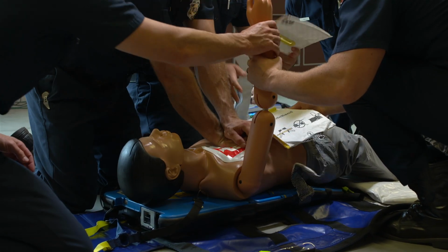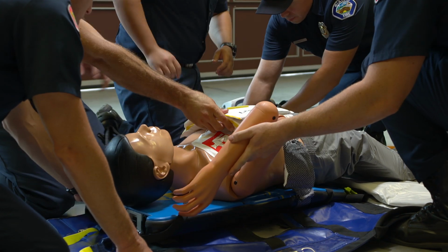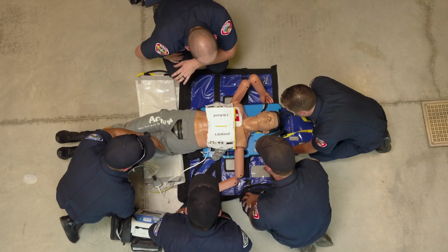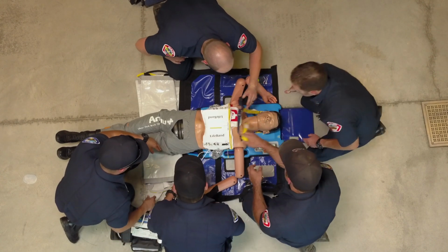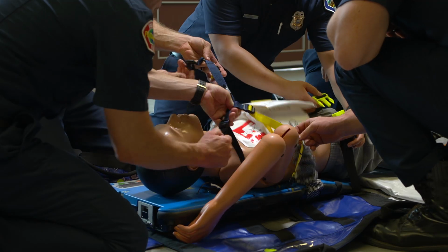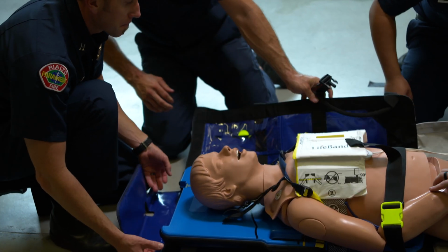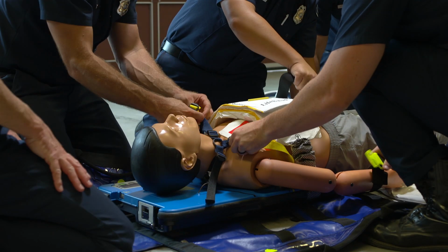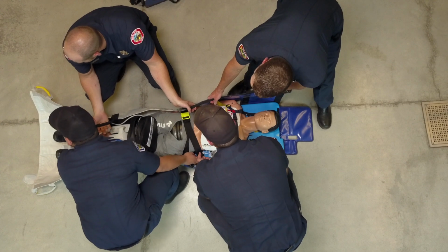They will put the AutoPulse band together, immediately restart the AutoPulse so the time off the chest is as little as possible. Then they will place the straps to appropriately hold the patient in place on the AutoPulse, and then deploy the quick case so that they can move the patient quickly onto a gurney. Because nothing trumps compressions, nothing.